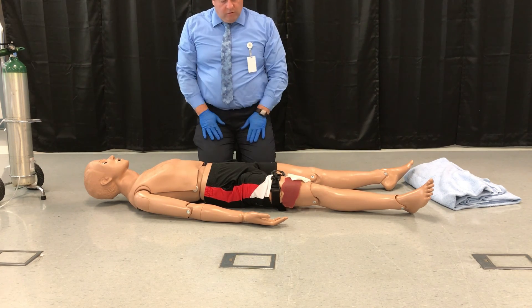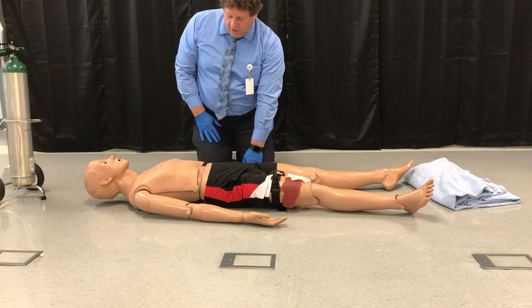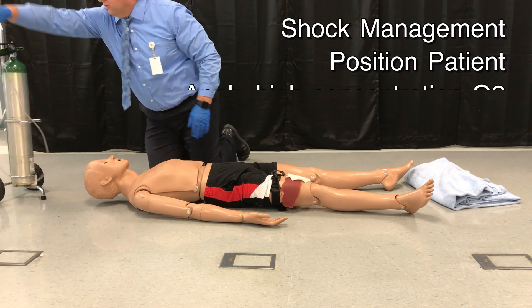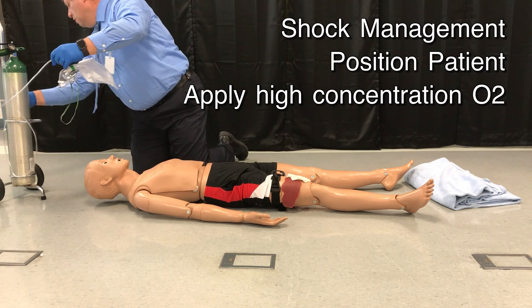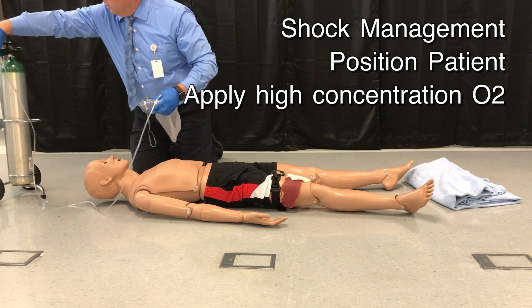I now notice that he is exhibiting some of the signs of shock. He looks pale and he is tachycardic — I have a weak pulse. I am going to apply oxygen via a non-rebreather mask at 15 liters per minute.